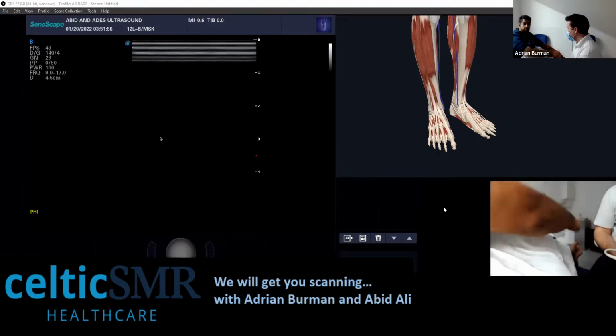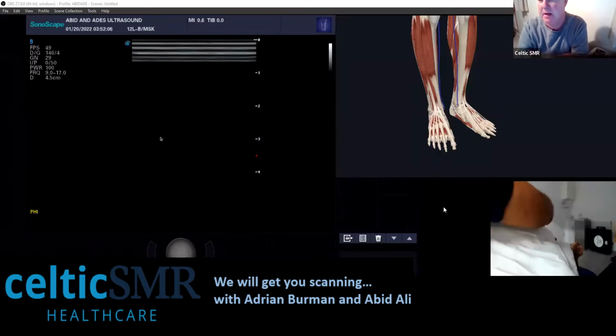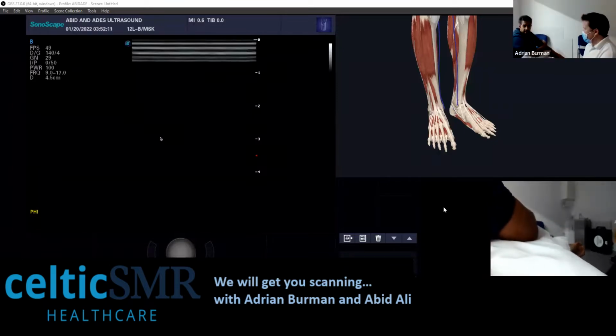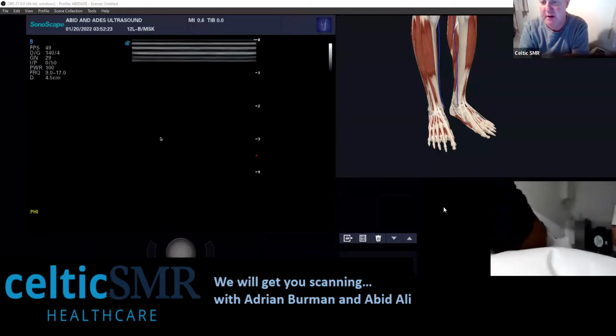Okay. Lovely. So any more questions? There's not. But thank you for that. That's a good little insight into the elbow. Thank you. Anybody like anything covering next? Otherwise, we'll maybe just go to the shoulder, perhaps. Or do you want to do a bit of foot for the pods out there? Yeah, if you've got something lower limb, we've got a good number of our pods with us this evening. So if you've got anything knee or ankle, would be good.